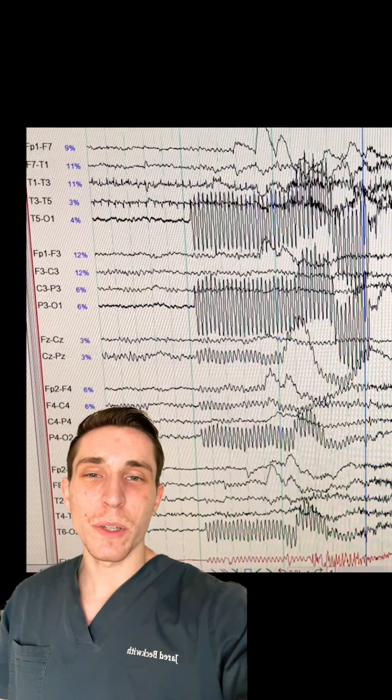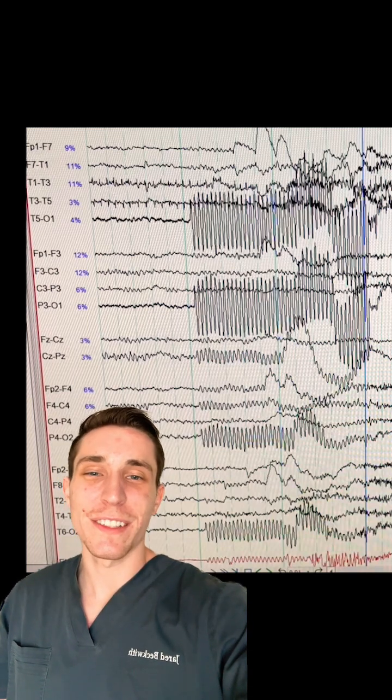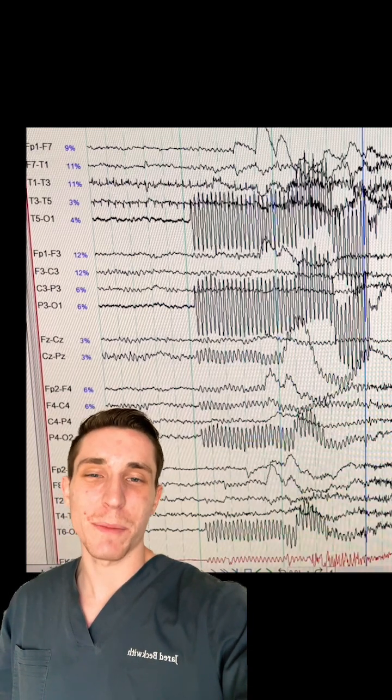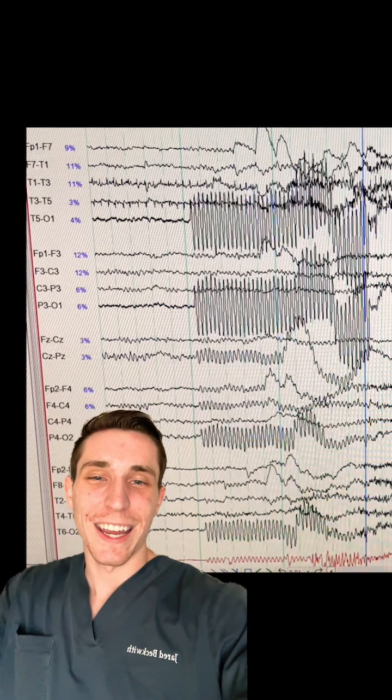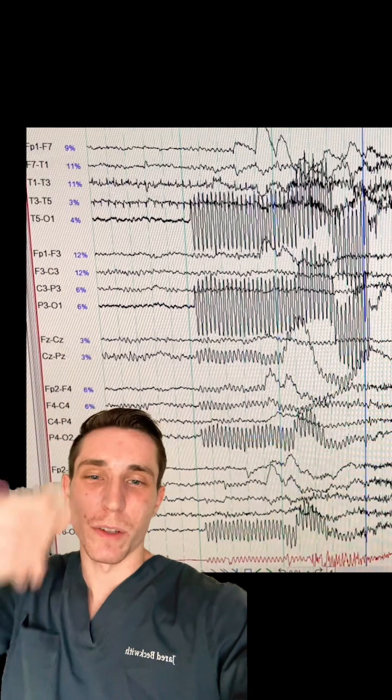Now, while doing a 12-hour shift of monitoring, you're going to see all different types of things, and this is just one of them.